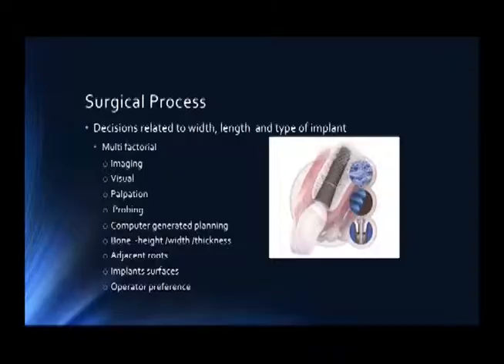Certainly there are a multitude of things to think of when the surgical doctor is deciding what type of implant, the length, and the width of the implant that is going to be placed. Obviously, the digital imaging available in treatment planning, their visual inspection, and palpating the actual bone itself so they can feel it and look at it, probing that area.